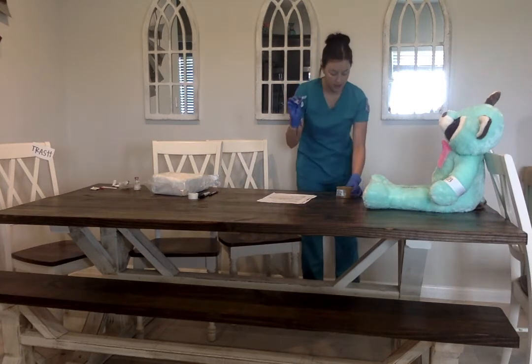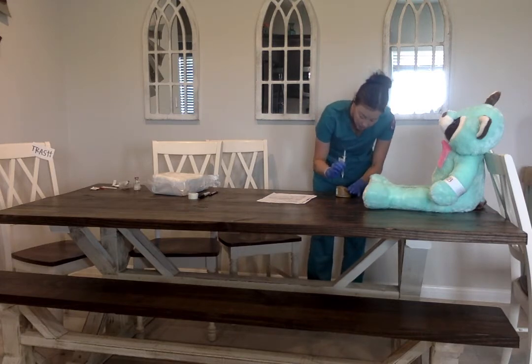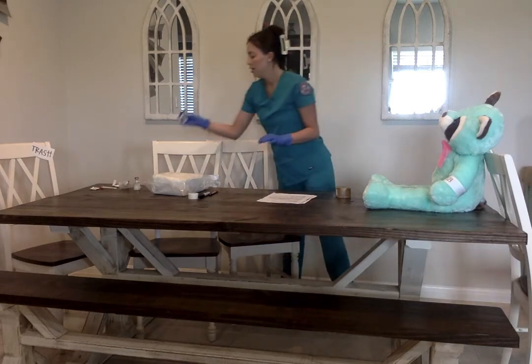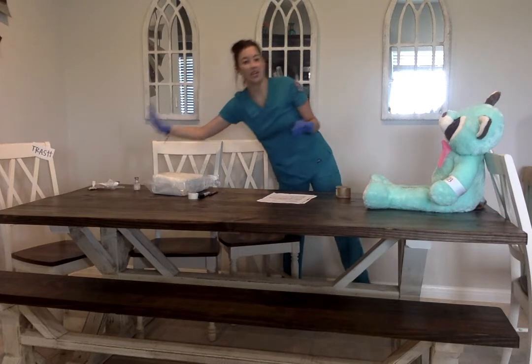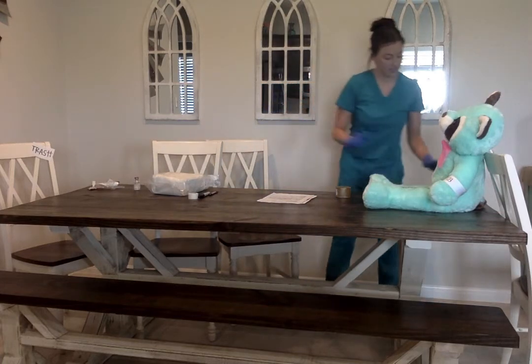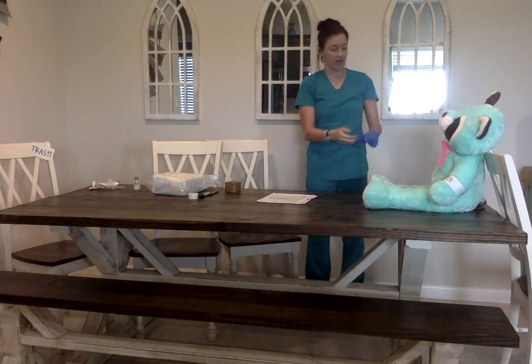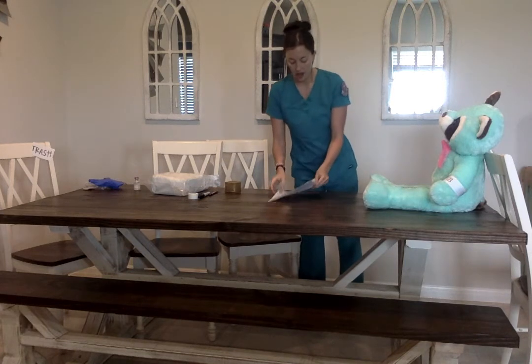Okay, you ready? Just gonna Z-track. And at a 90-degree angle, just a little poke. Okay, alrighty. Activating the safety, and I'm putting it in the sharps container, not the trash. I'm gonna apply a Band-Aid. Okay, how was that? That wasn't too bad. Trash. Hand hygiene.